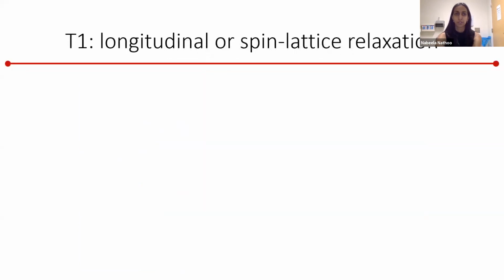Okay, so after that oversimplification, the gist I want, at least for people who don't do imaging and have no plans of doing imaging, is to understand that within your body you have mostly water, and with that you have hydrogen atoms, which are just a single proton. We can exploit that, because essentially these are little magnets themselves, with a large magnet to produce contrast in images.